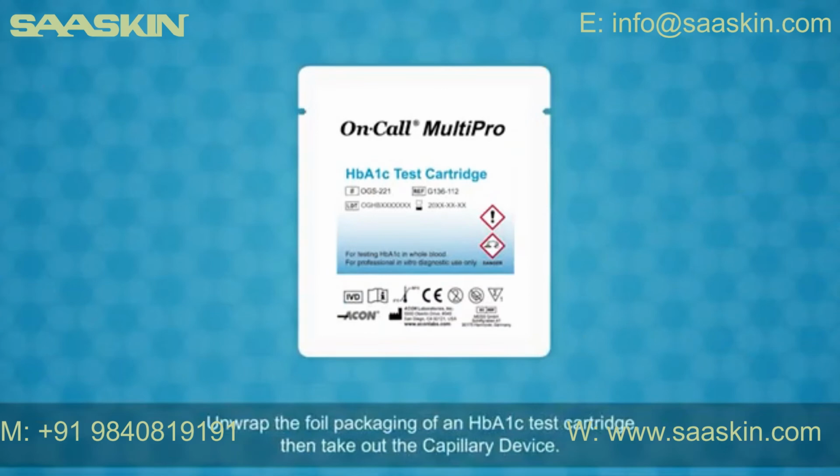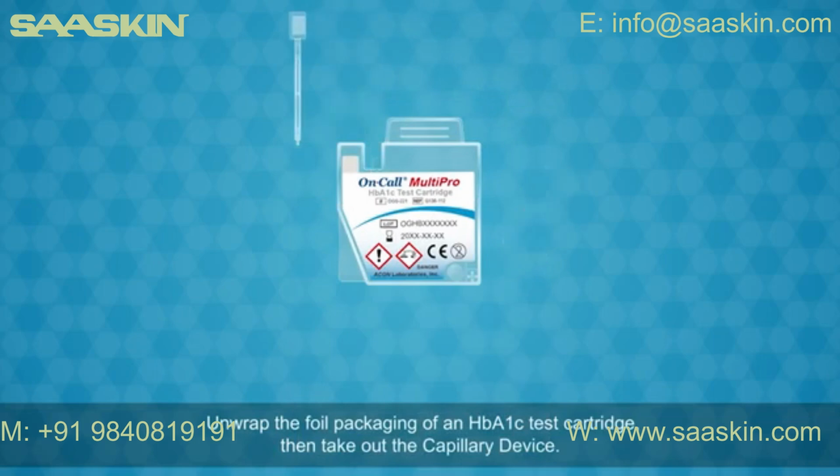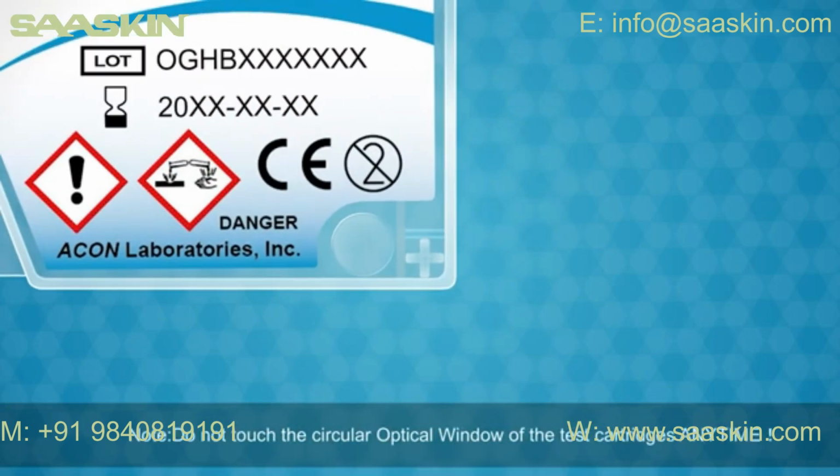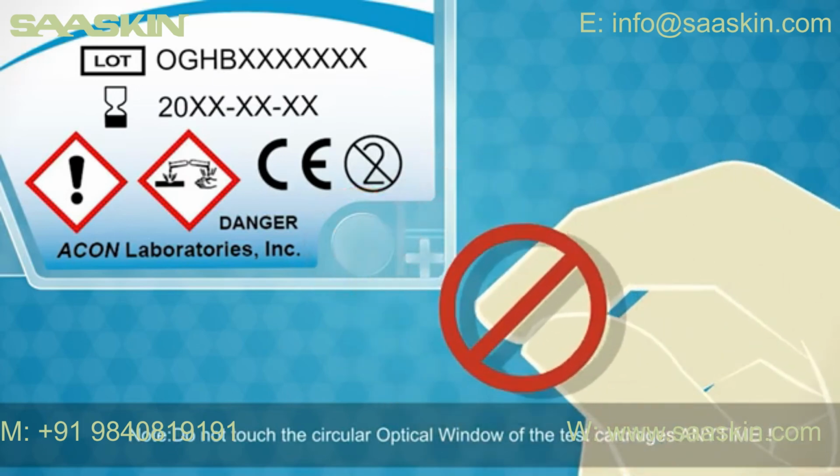Unwrap the foil packaging of an HbA1c test cartridge. Then take out the capillary device. Note: do not touch the circular optical window of the test cartridges anytime.